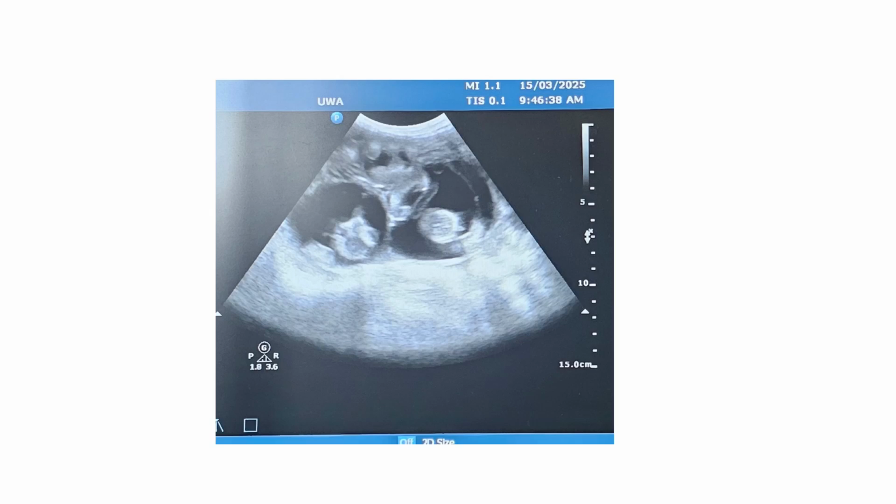So let's have a look at an ultrasound image. This is an image of a sheep pregnancy, but many of the components are going to be the same, except for the fact that this is a twin pregnancy. So we're hoping there's not going to be too many of those in cattle. Fluid does not reflect sound well, but it does transmit sound well. So the basis of most of your images is that your fluid should be black.